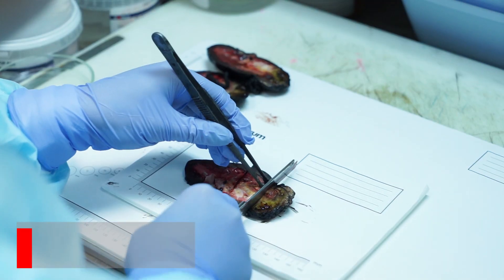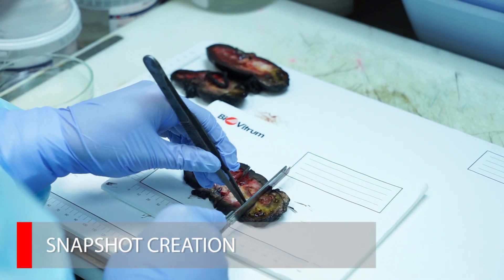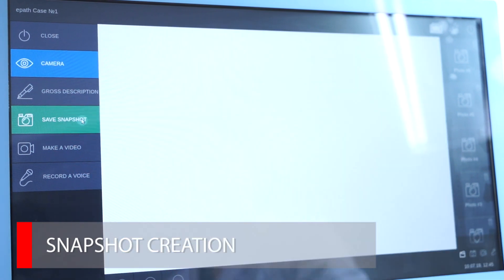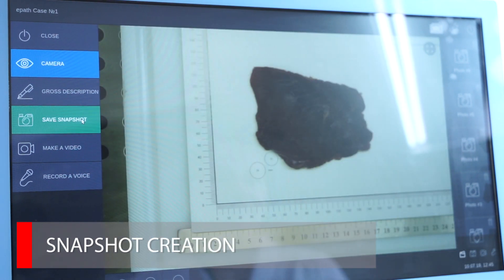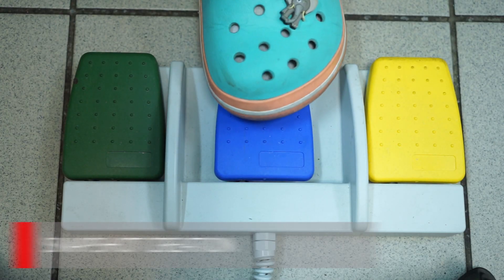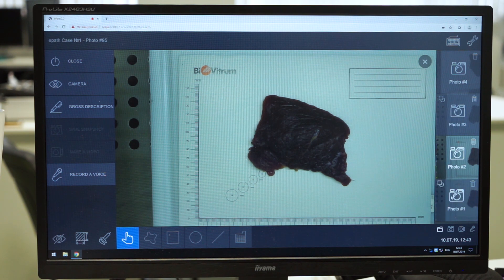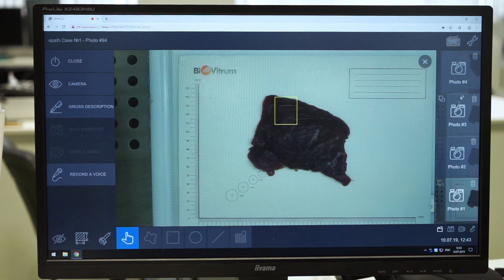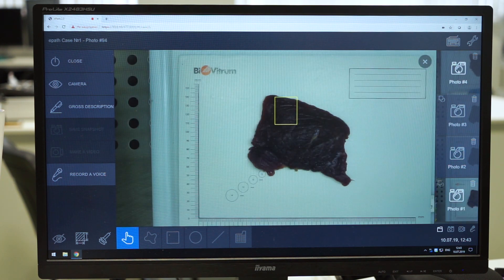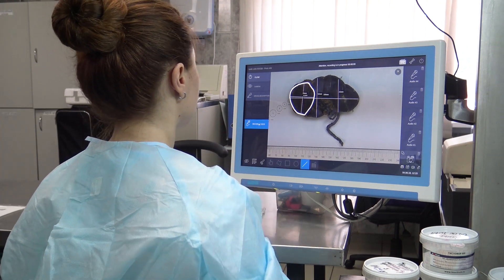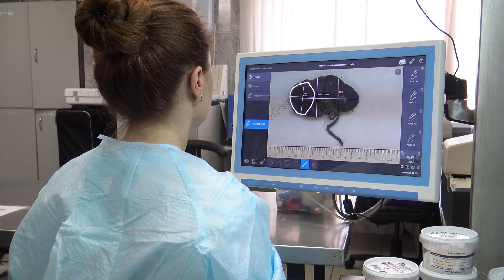During the work, the pathologist can take pictures of the material. It can be done using the button on the display or with the pedal. The system allows you to keep an electronic archive of images. The pathologist can also shoot video and record audio.